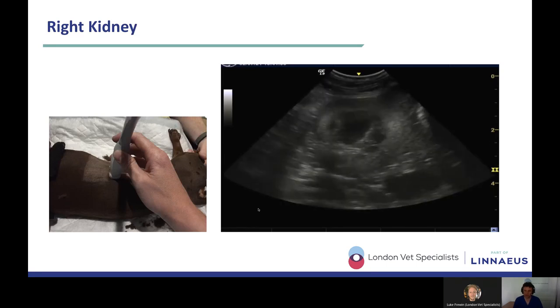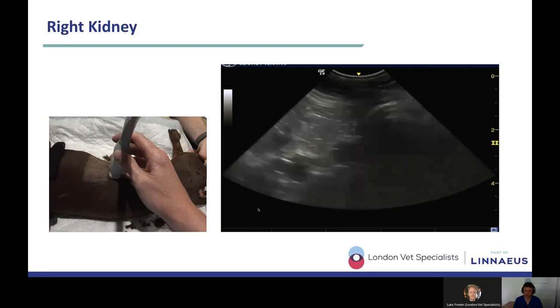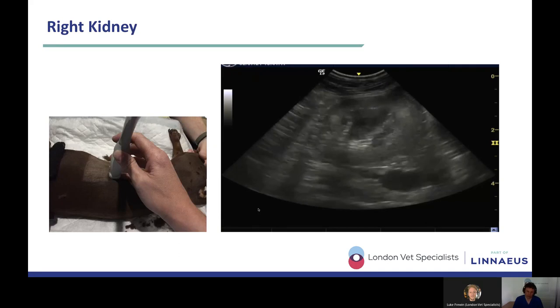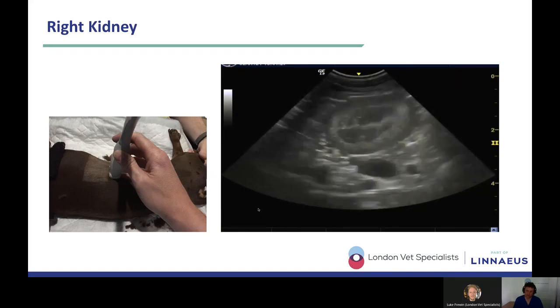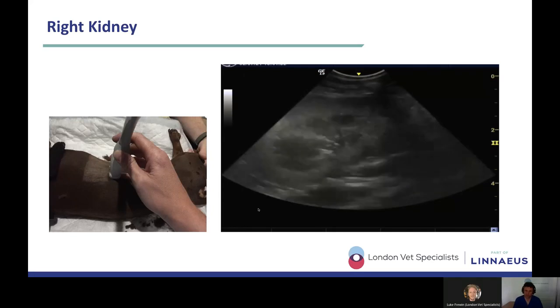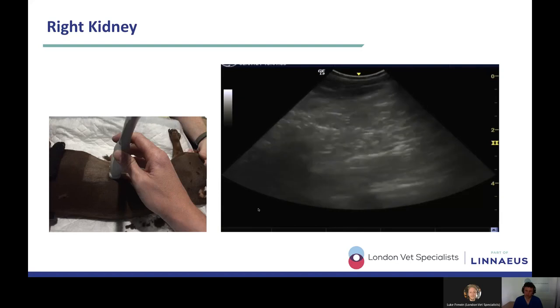Kidney shaped, smooth margins, nice bright cortex, nice dark medulla, beautiful corticomedullary demarcation, slightly brighter fat around the renal pelvis, normal renal pelvic size. And I don't necessarily want you guys to get hung up on measurements. If the renal pelvis is enlarged, if it's up to about 3 or 4 millimeters, whether it be a dog or a cat, then I wouldn't get too concerned about that. Quite often patients that have been on intravenous fluids, their renal pelvises will be slightly enlarged. And I'd include anything up to about 3 or 4 millimeters thick as a slightly enlarged renal pelvis.